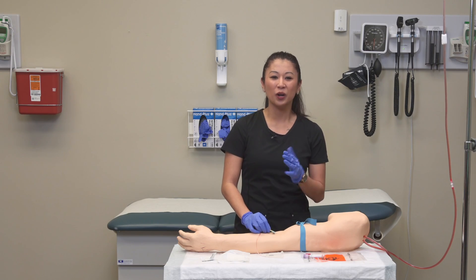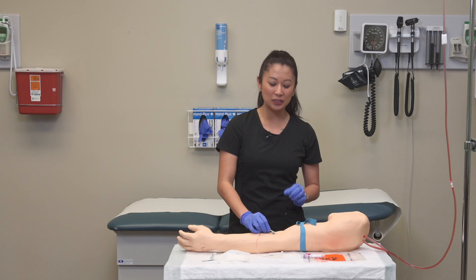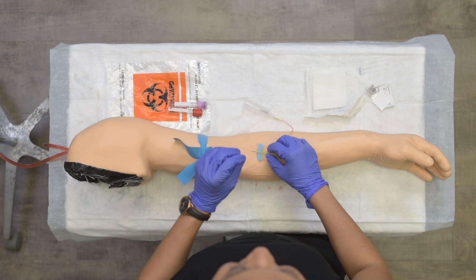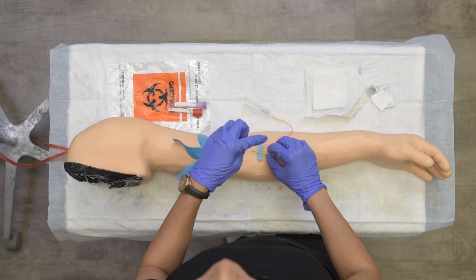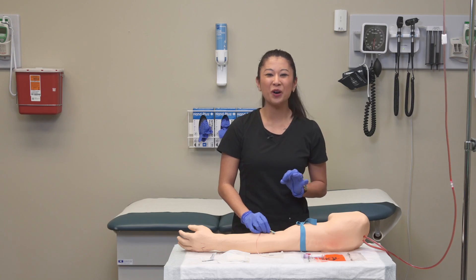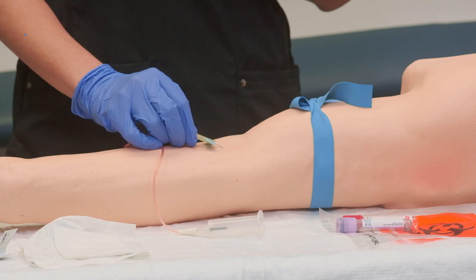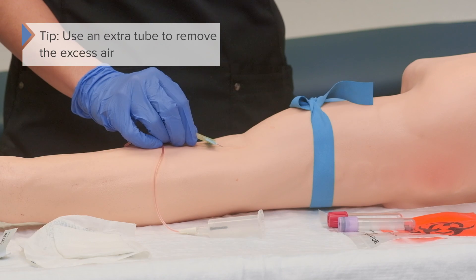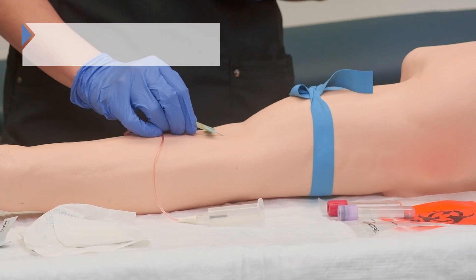Just keep in mind — this is my personal preference — I used a butterfly or wingtip needle. Sometimes because of this extra tubing, there can be some air that gets into the tubing. We do not want this in our lab sample. Therefore, it's a great idea to use an extra waste tube to remove the excess air.